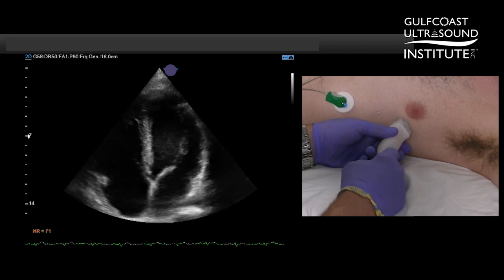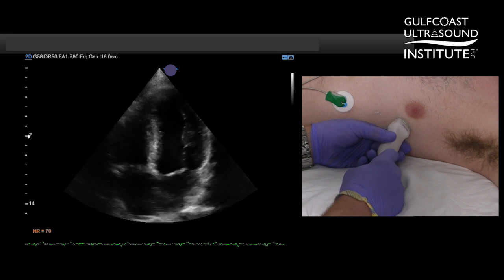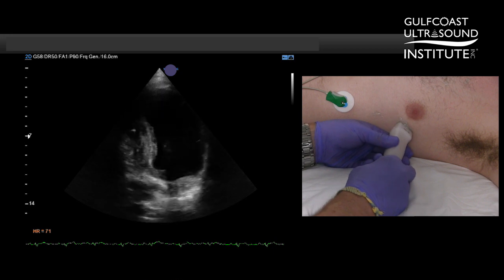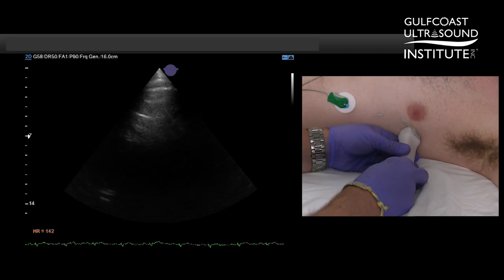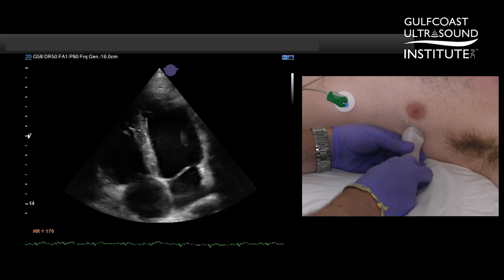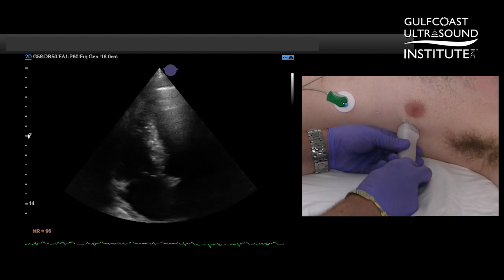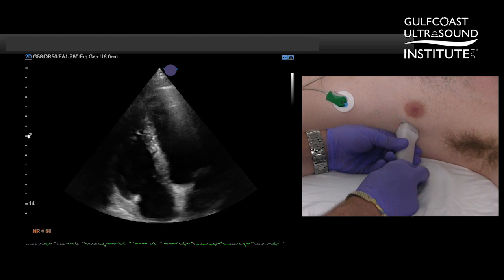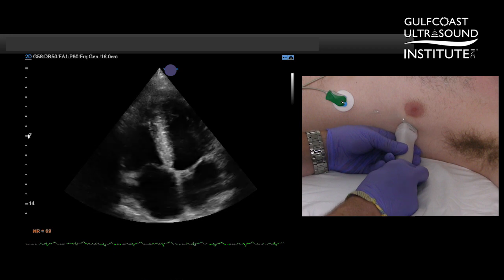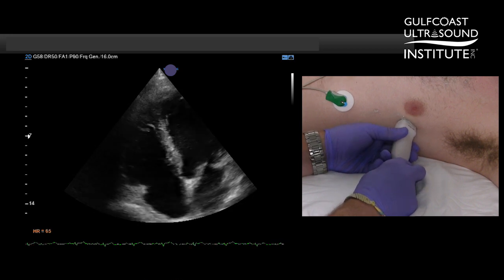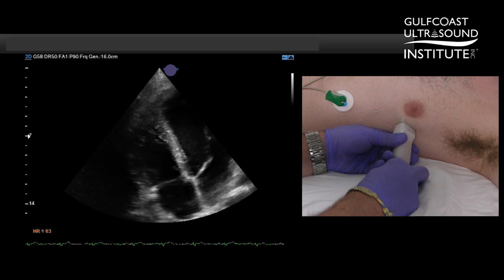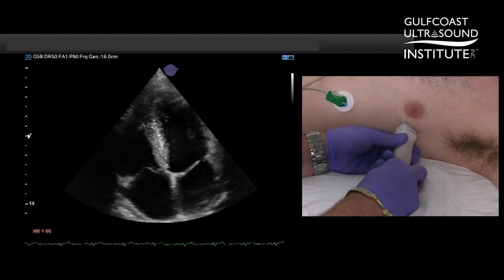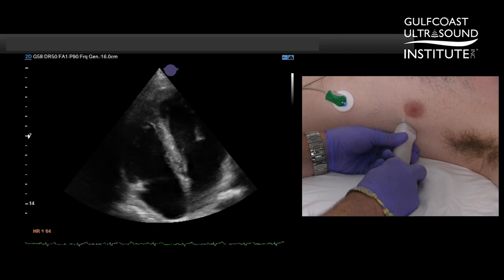We start in a traditional apical four chamber view, and then we are going to take the probe, slide much more to the lateral aspect, and then aim the probe anteriorly. What you'll start to notice on the screen is that the RV becomes the primary focus. The angle isn't necessarily as important as where the RV comes into view, and we can see that we've excluded the left side, focusing on the RV and trying to visualize as much of the lateral wall, the basal segment, and the apex as possible.